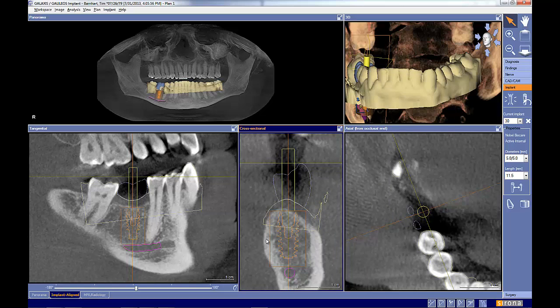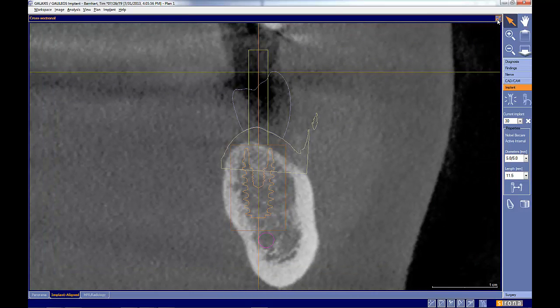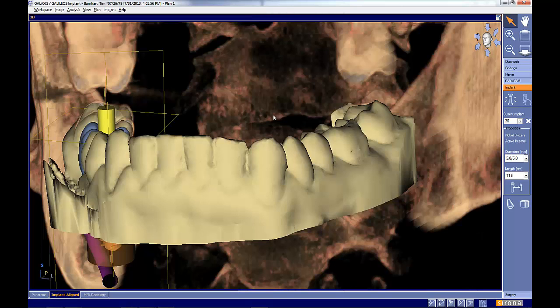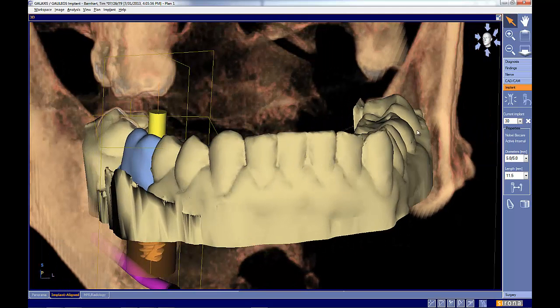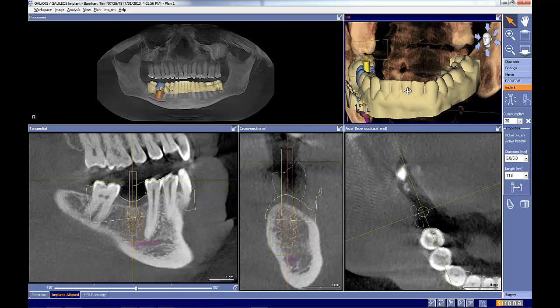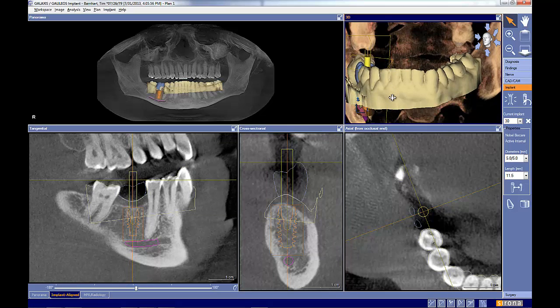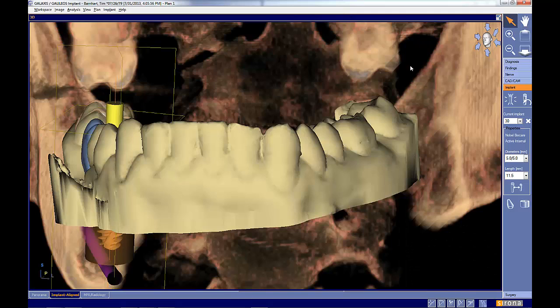Now we're going to come to the central groove, and we're going to have a little bit more space there. So let's take 2 seconds to look at this a little bit closer. Let's take a look from right here. We know that our lower teeth, as you can see here, are tilted in as we go more posterior. So our implant in an ideal world should also follow that as well. As we take a look at this, I think we may be a little bit thin here. We're not, but one could assume that it's not centered ideally. So I think if we take this implant plan and just tilt it a hair to the lingual there, we gain more space, better centered, and now we're also coming through the central groove of the tooth, and the implant is slightly tipped. So let's take a look at this view here.